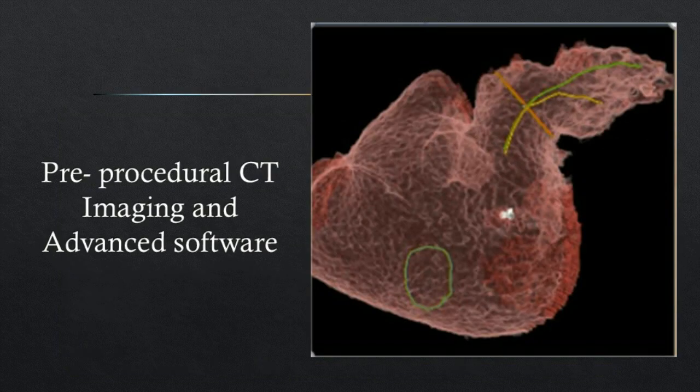One of the coolest advancements in structural heart can be seen within imaging and software. In this example, GE Healthcare's Valve Assist AW software is used to take the preoperative CT and utilize it intra-procedure as a dynamic 3D roadmap during a left atrial appendage closure. The 3D CT overlay is registered to the patient and fused with fluoro imaging, thus eliminating the need to update as the tube is angled, as the table moves, etc.